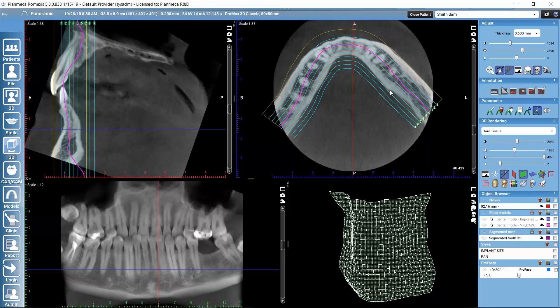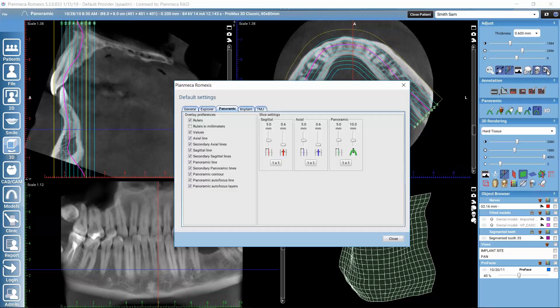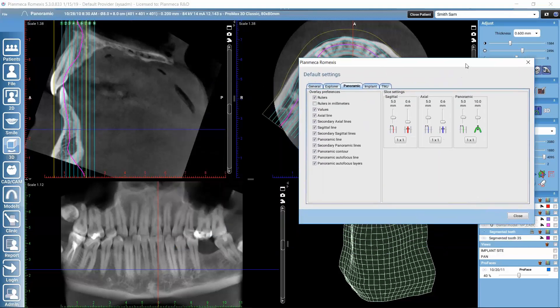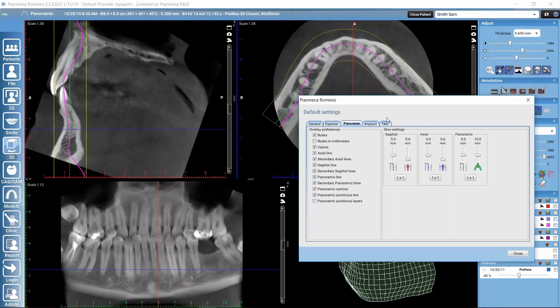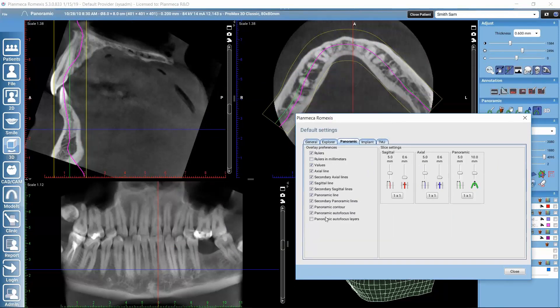In the axial view, we can also see the autofocus layers in addition to the improved panoramic focal layer. If we would like to hide any of these, we can open the default settings and hide the extra layers by clicking there.